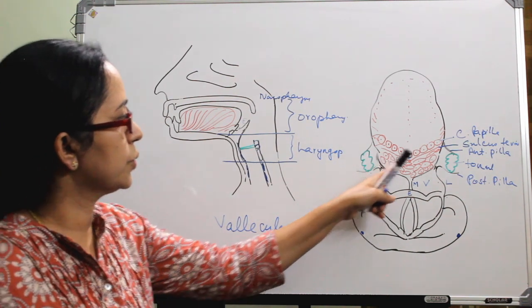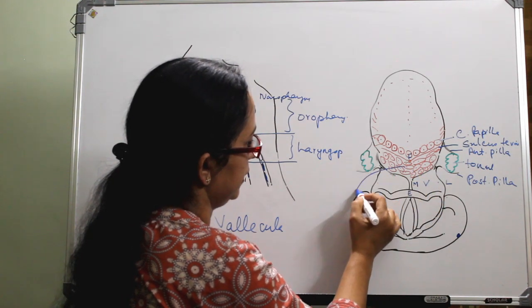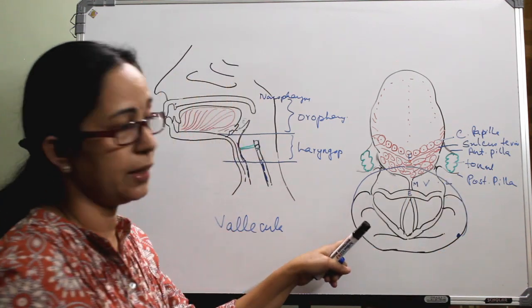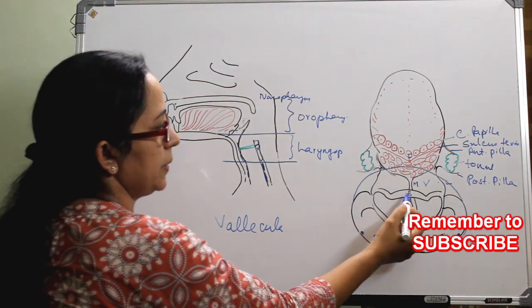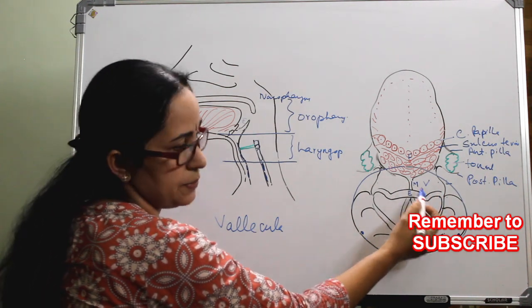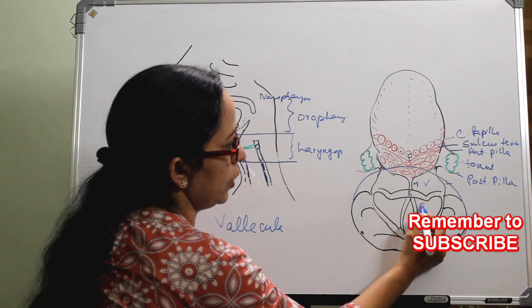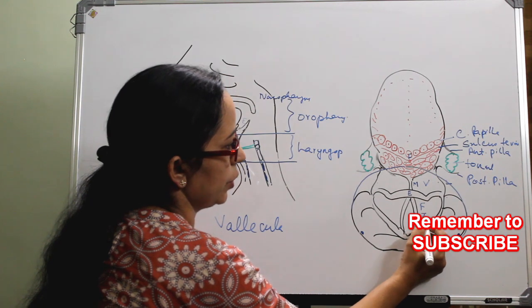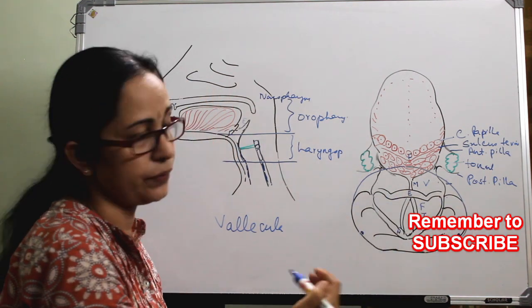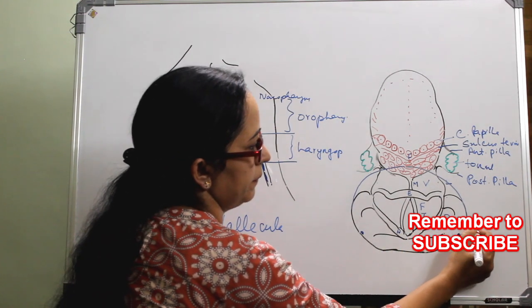Okay, so this picture, roughly this part, you can see by an indirect laryngoscopic mirror. From the epiglottis, the glossoepiglottic folds, medial and lateral, and between them comes the vallecula. Then this is the false cord, and this is the true vocal cord and arytenoid, and on the sides of that there are two potential spaces called pyriform sinus.